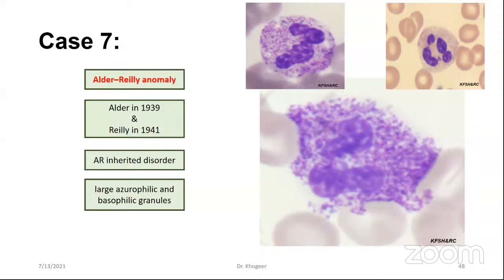It can be associated with mucopolysaccharidosis, which is a group of metabolic disorders caused by the absence or malfunctioning of lysosomal enzymes needed to break down molecules called glycosaminoglycans.